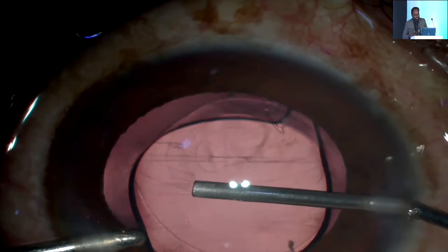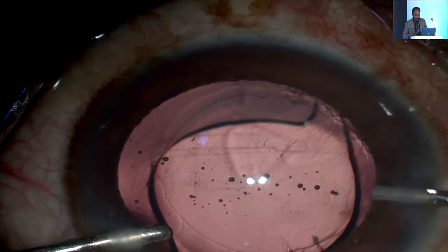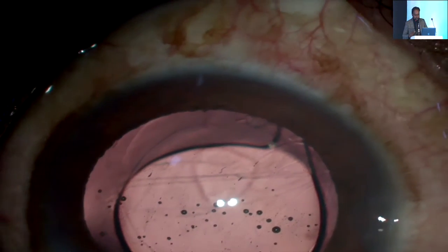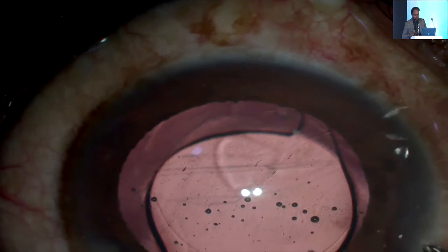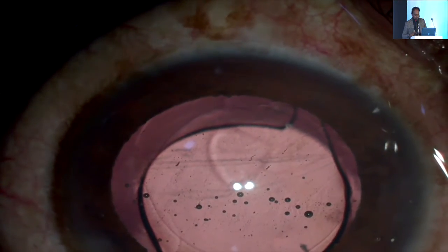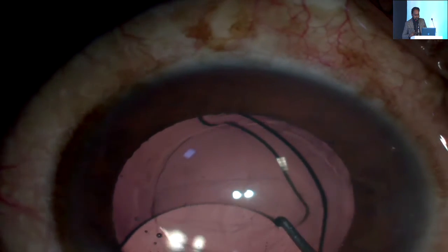Partial optic capture. So here again, since I said I inject most of my lenses with irrigating saline, I didn't want the anterior chamber to collapse, because that can also lead to the lens dropping inside. So fill the chamber with viscoelastic. You can see the PC there. So just going there, making sure that the haptic is first brought out.